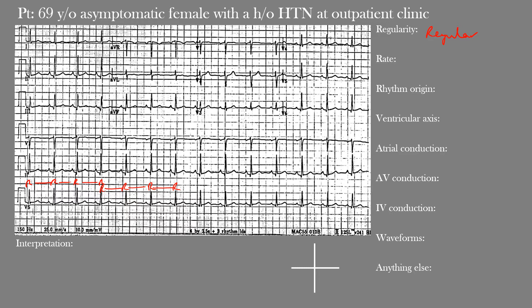There are a couple of ways to calculate heart rate with a regular rhythm. One approach: the standard 12-lead EKG represents 10 seconds across, so multiplying by six gives you 60 seconds. Count the number of QRS complexes going across the EKG and multiply by six to get a rough estimate of beats per minute. Counting here, we have 14 QRS complexes — 14 times 6 equals 84 beats per minute. You can do the same with P waves to get the atrial rate.